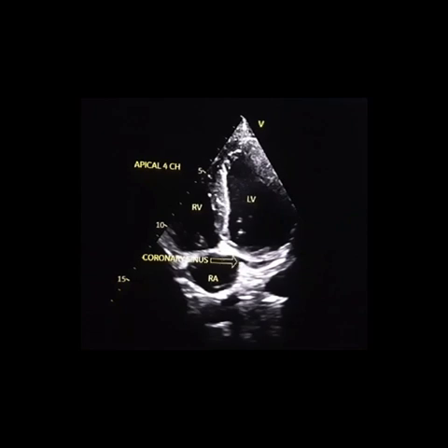This is the drainage area, and this is running transversely, and actually while doing pacing you put the electrode from the right atrium through this hole and go into the posterior part of the left ventricle through the coronary sinus. The electrode should pass through that. There is sometimes a small valve seen at the mouth of the right atrium and the coronary sinus, which is known as Thebesian valve.